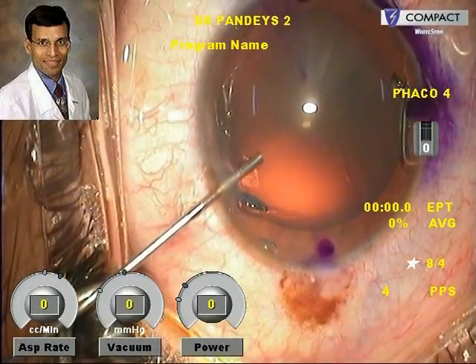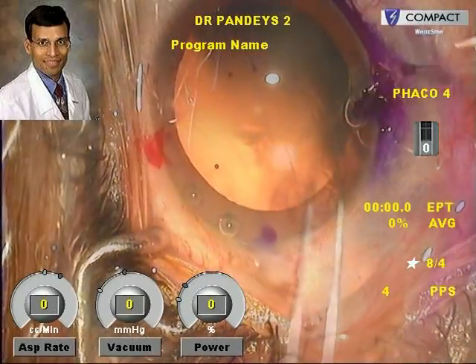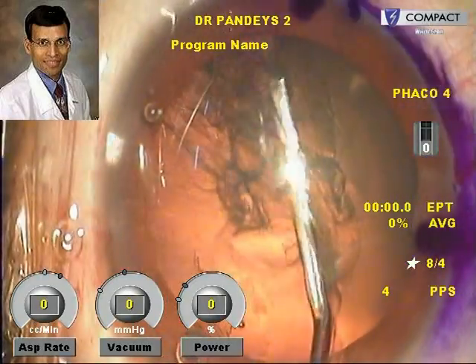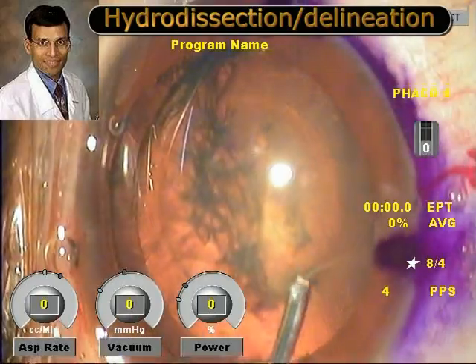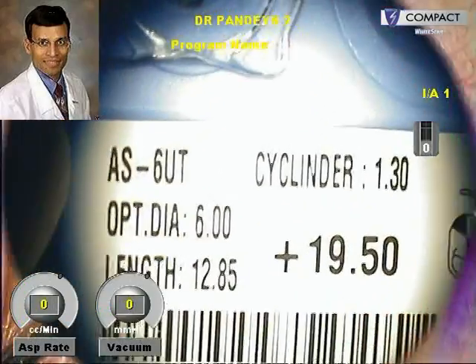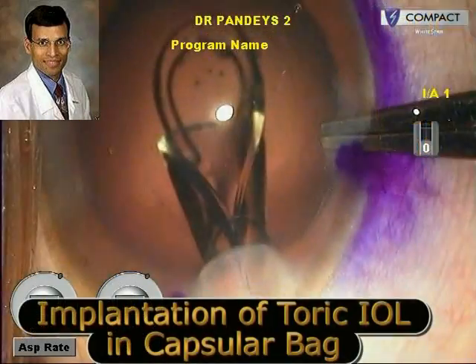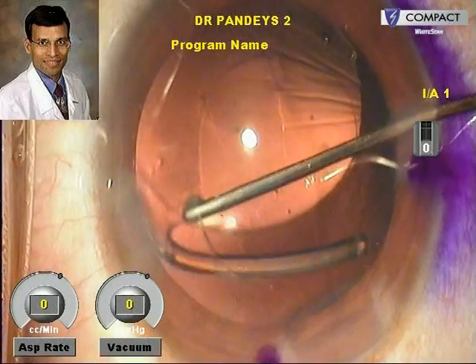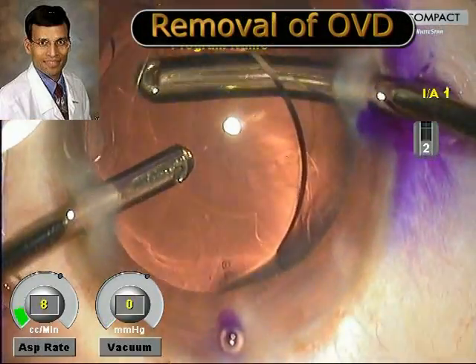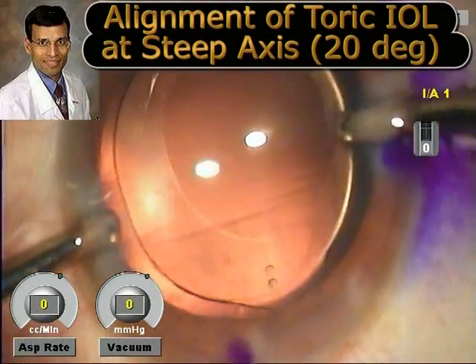We then coat the endothelium very well with a dispersive ophthalmic viscoelastic device. The main incision at the steep axis and the sideport incisions are made, and a good capsulorrhexis is performed — for all refractive IOLs like toric and multifocal, perfect centration within the capsular bag is of crucial importance. Bimanual irrigation aspiration was done; this was a soft lens so phaco was hardly needed. This is a plus 19.5 diopter toric IOL from Care Group India being implanted in the capsular bag, dialed into place achieving proper positioning along the astigmatic axis. The viscoelastic is then removed from under the IOL and final positioning is checked.